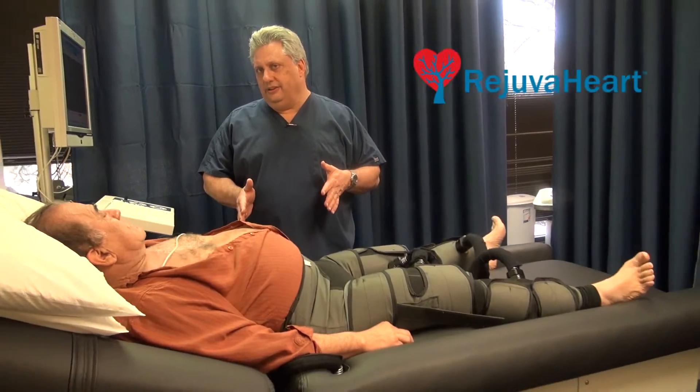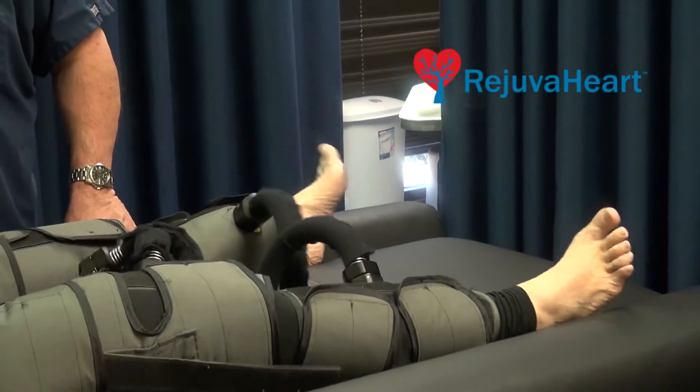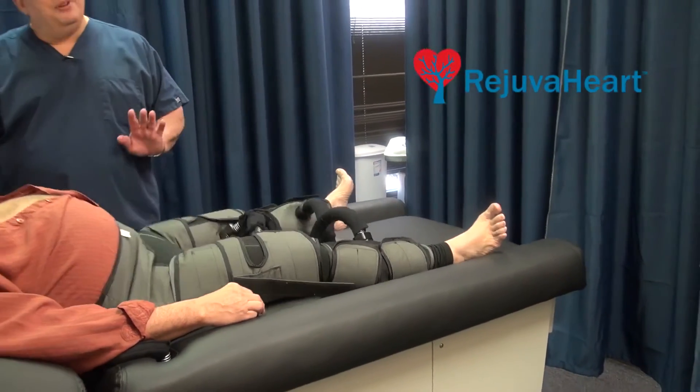How is the blood pumped? By compression of the calf, the thigh, and then the abdomen. And the blood is literally thrown into the upper body and the lower body, therefore creating collateral circulation.